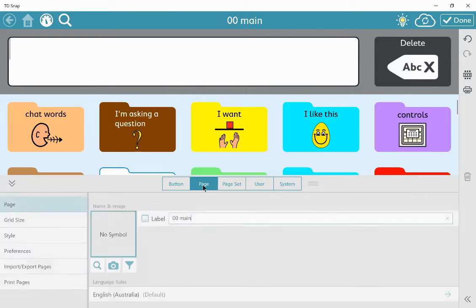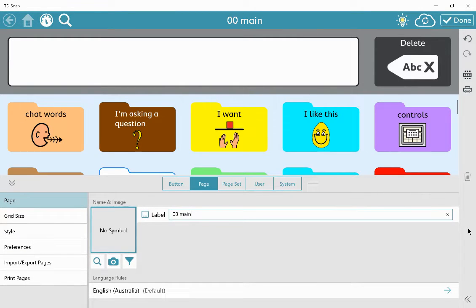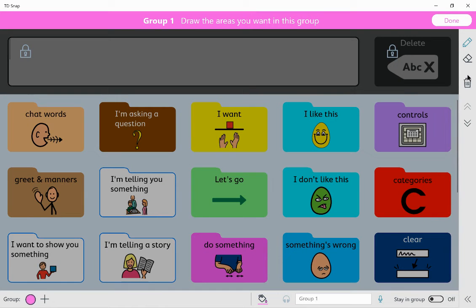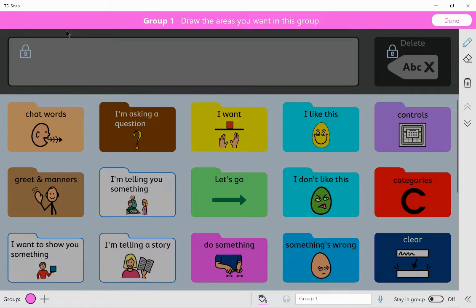So if you go to page, you can see here scan groups. This is where you can set up what group you want in the scan.